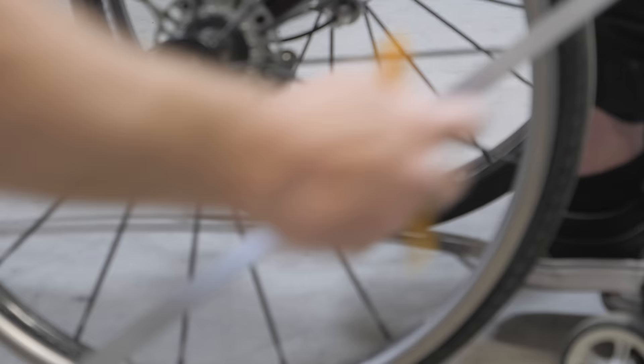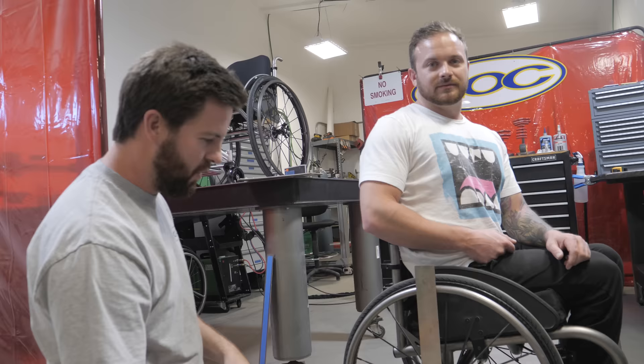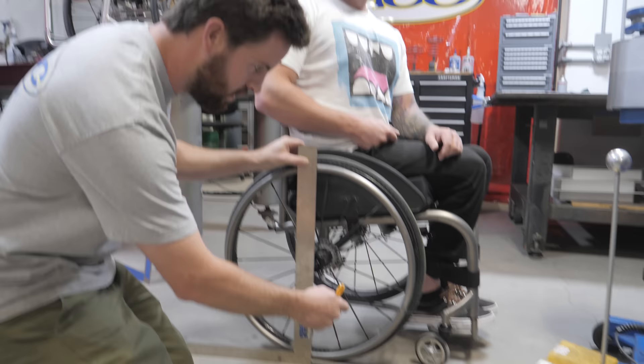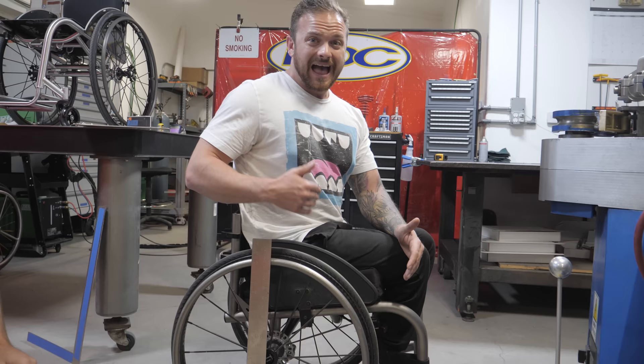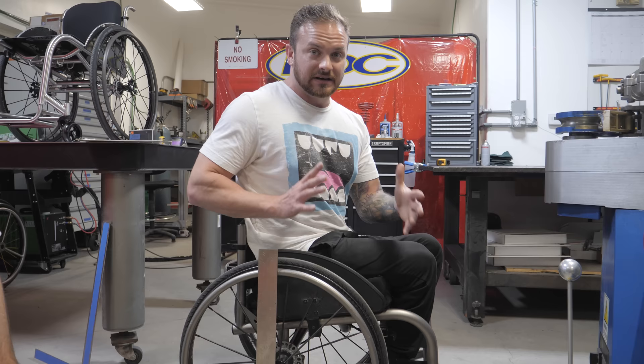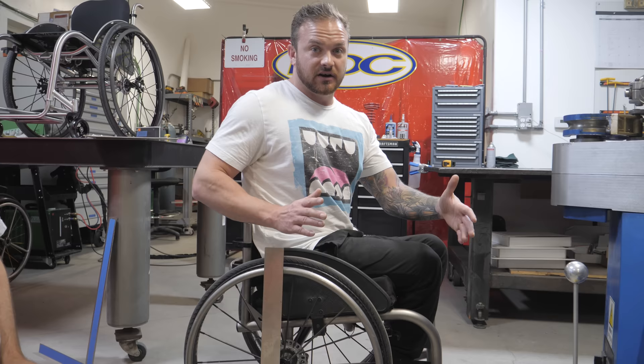We are now measuring wheelbase — the measurement from center of rear wheel to center of caster housing. The longer the wheelbase, the more stable the chair when it comes to any type of forward tipping. However, the shorter the wheelbase, the more compact you are and the smaller places you can get into and turn around in. The longer the wheelbase, the longer your chair, so your radius for turning is much larger.